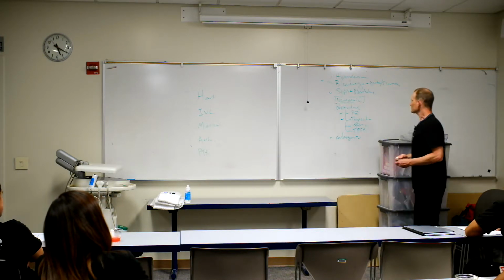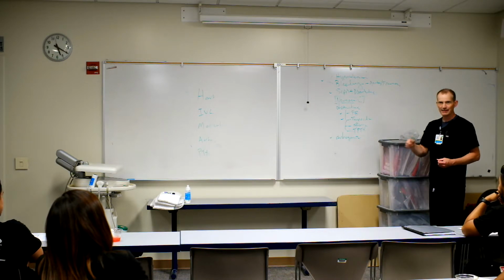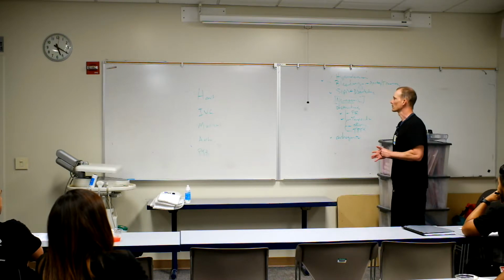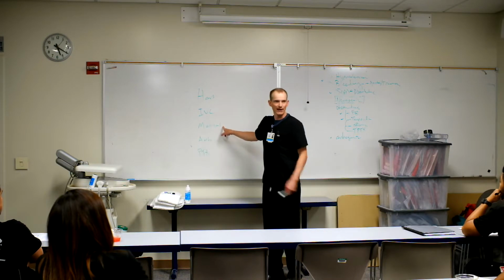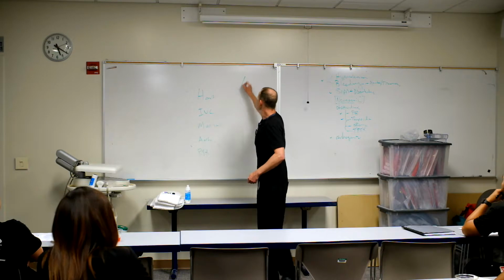So the small IVC should clue you into those ones. Is that really clear? Everyone intuitively knows that, right? That's how that's going to work. Okay, so one thing you guys probably haven't seen is the Morrison's pouch, right? No? Okay, so what it looks like is this.